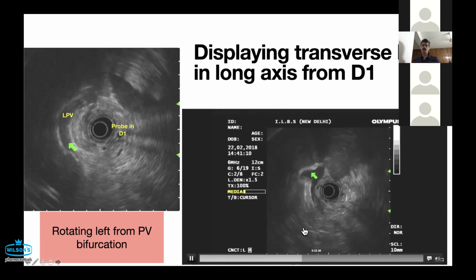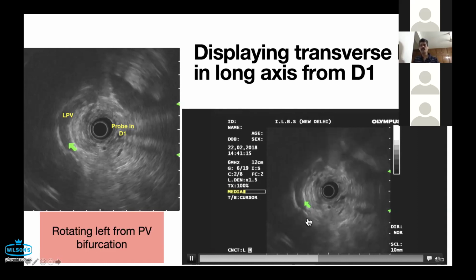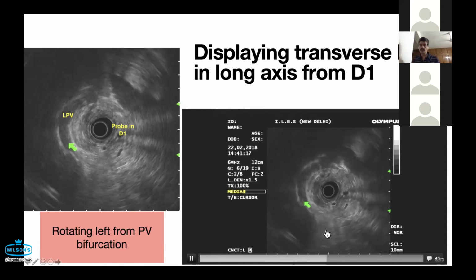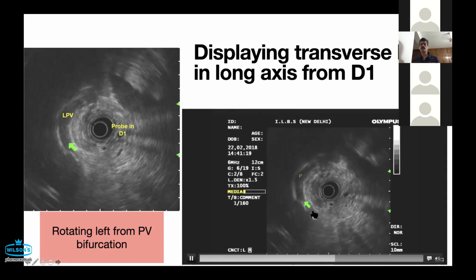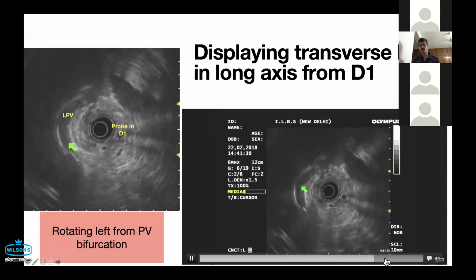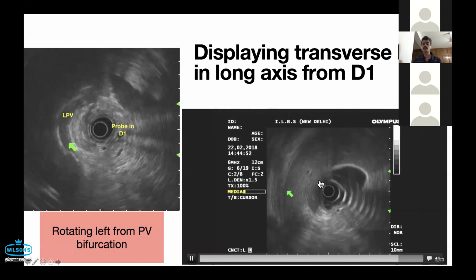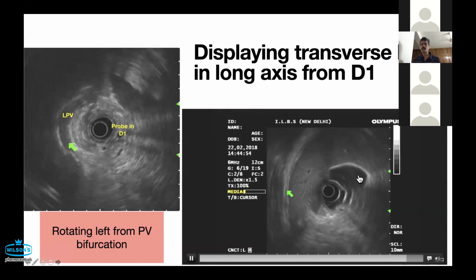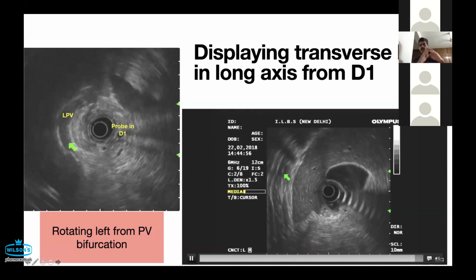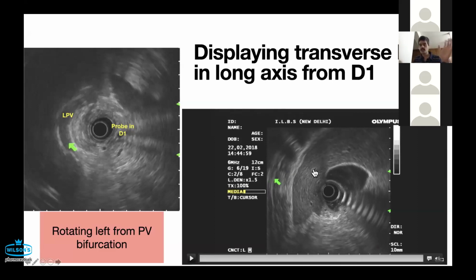And now if you drop your wrist, you can trace this left portal vein all the way down from the duodenal bulb. This is the transverse part of the portal vein on the undersurface of the liver till you reach the ligamentum teres. This is all transduodenal radial EUS view. And this is the gallbladder. Since the gallbladder and left portal vein are perpendicular, if you want to demonstrate the gallbladder from the duodenal bulb, you make the portal vein vanish, and then you will see the gallbladder.